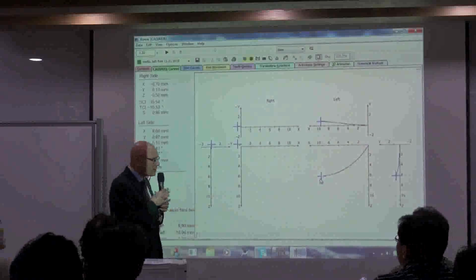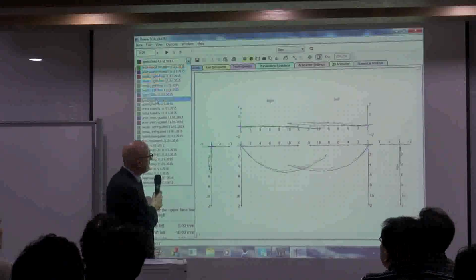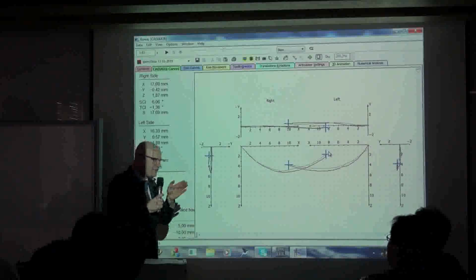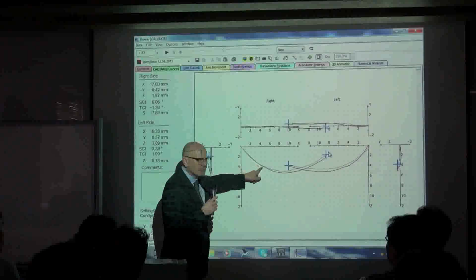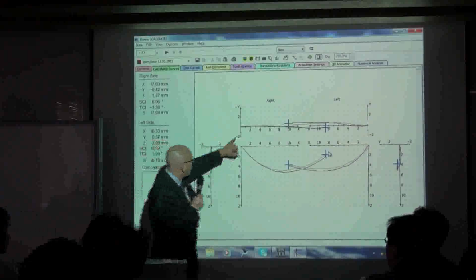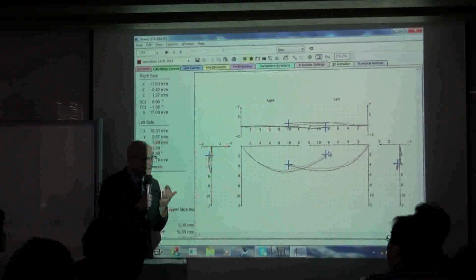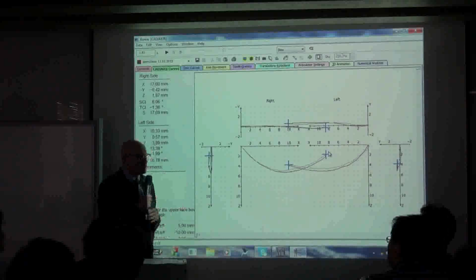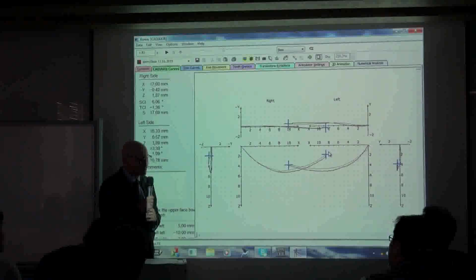Okay. Now we check open-close movement, please. It's not this one. She didn't do it. Okay. Again. Now, we said in protrusion, left and right asymmetry. If we check the starting here, it's very normal. And in the beginning, on 0. Open-close is a symmetric movement as well. But no asymmetry here in open-close. This means, open-close, no tooth contact possible. If we have deviation in protrusive movement, it must be tooth contact making the deviation. So occlusion is the cause for deviation of the movement in protrusion. Okay?